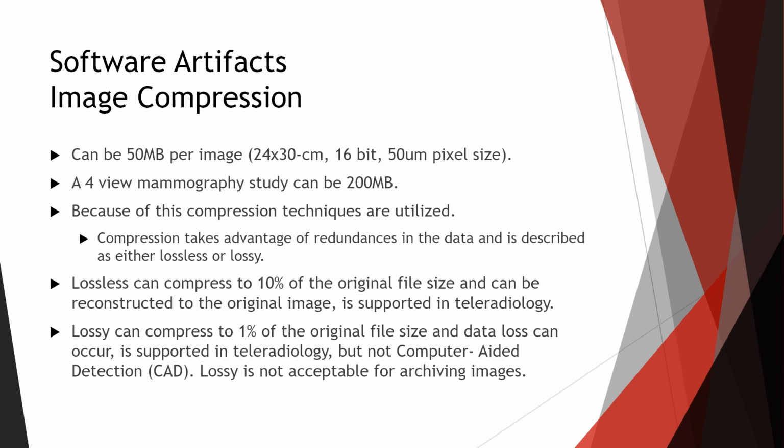It's supported in teleradiology, but not in computer-aided detection, for diagnosing the images with a computer and pointing out things to the radiologist. Lossy is not acceptable for archiving images, so for sending to PACS and things, we don't use the lossy technique of image compression because it can cause artifacting.